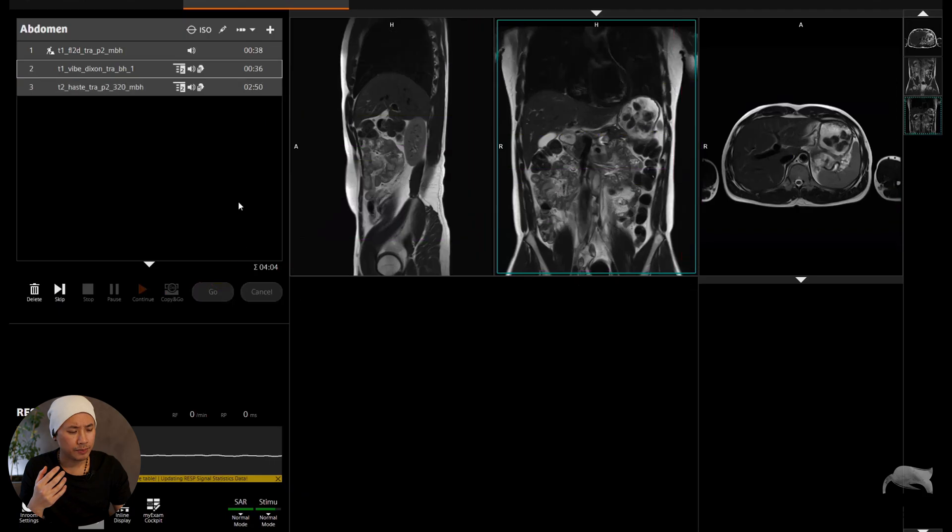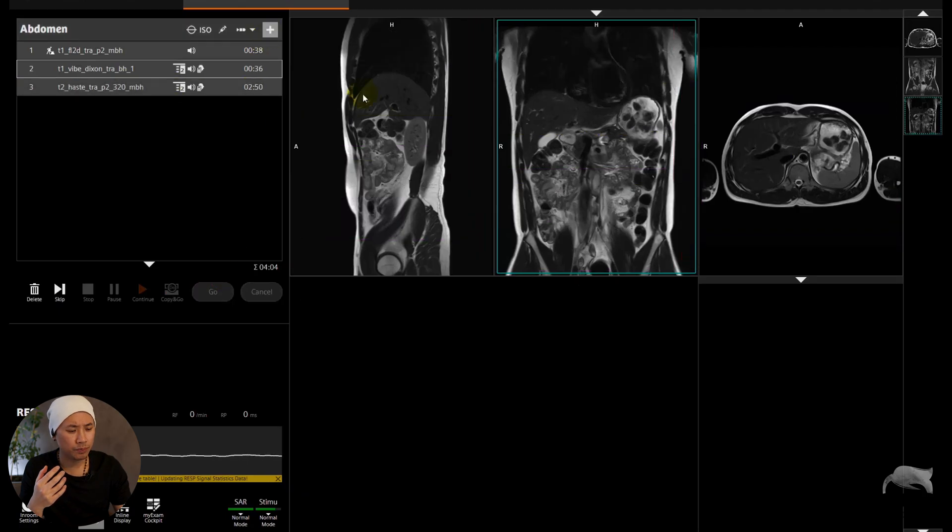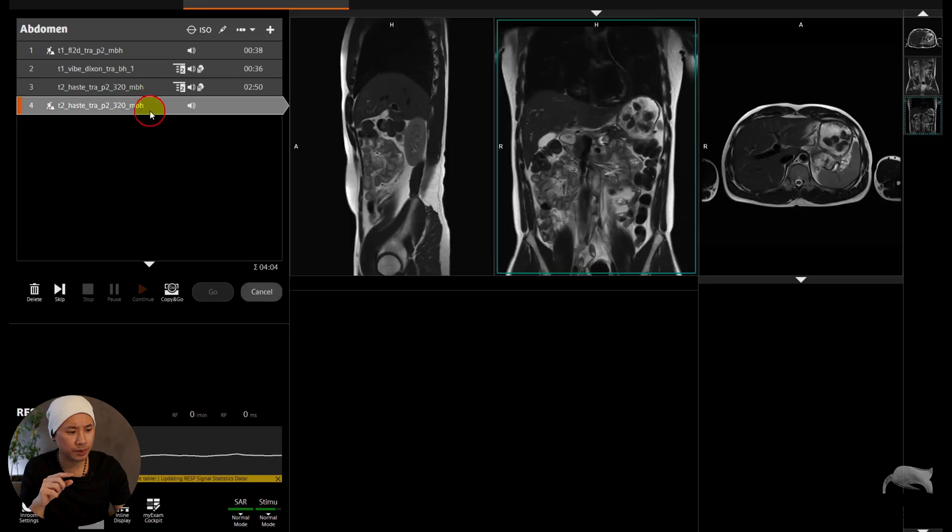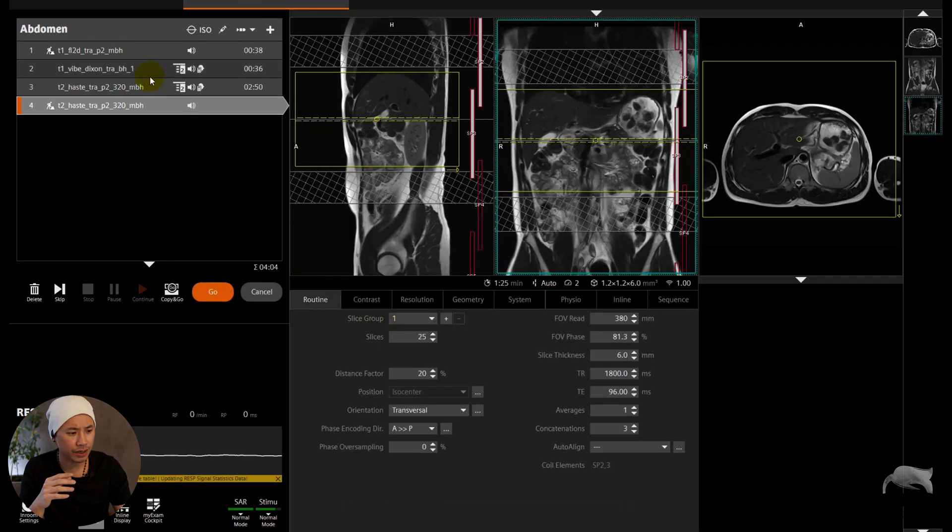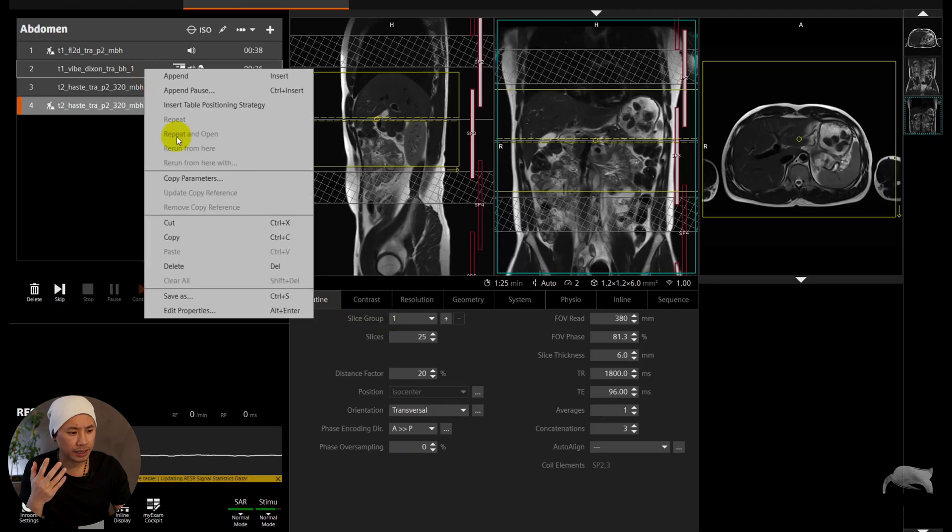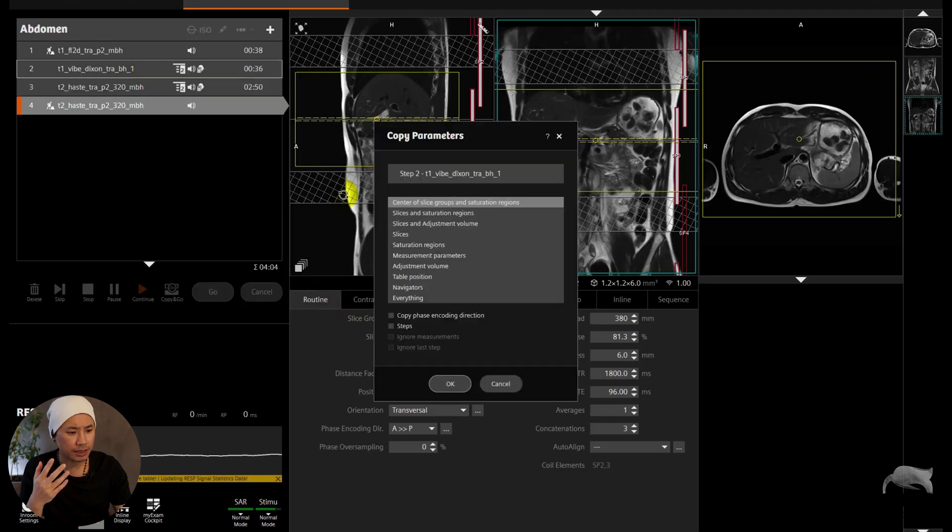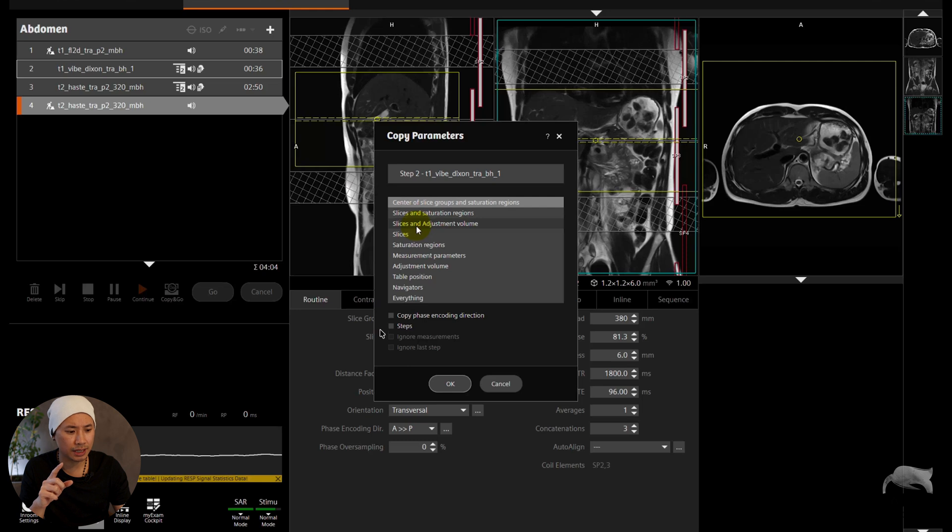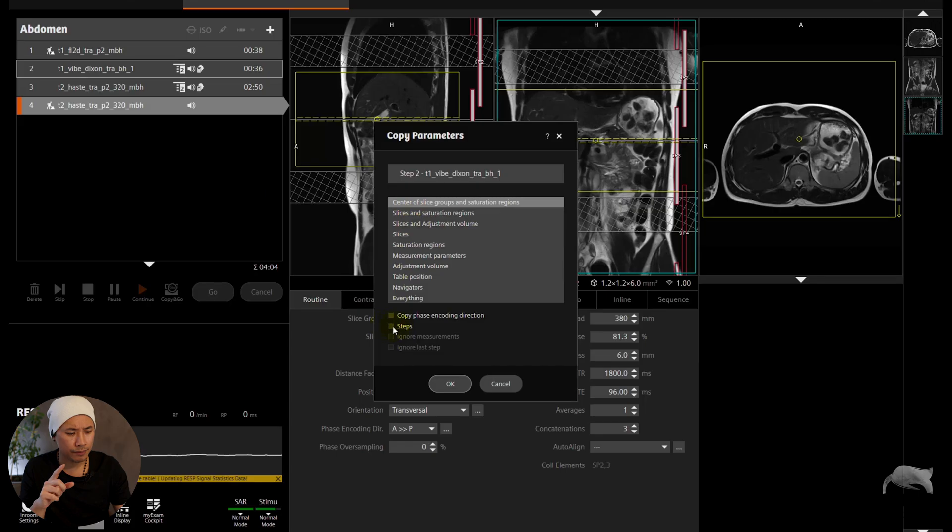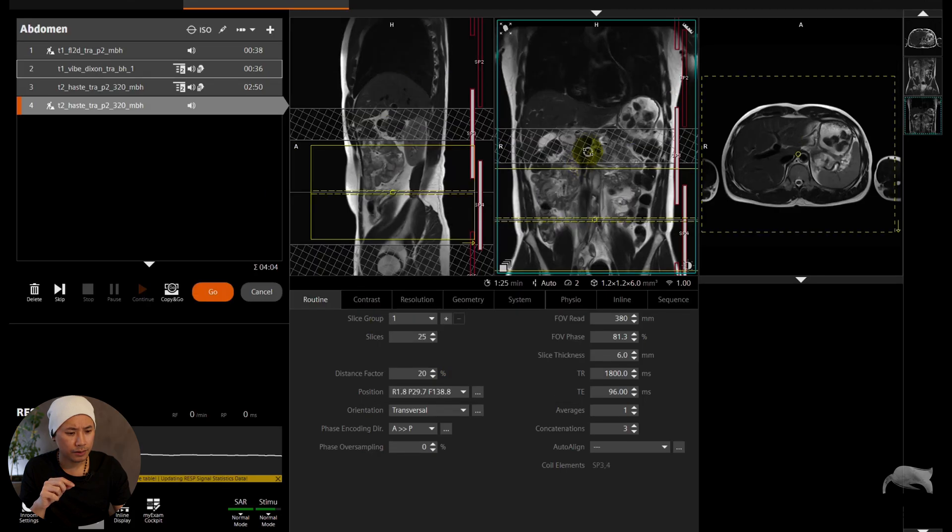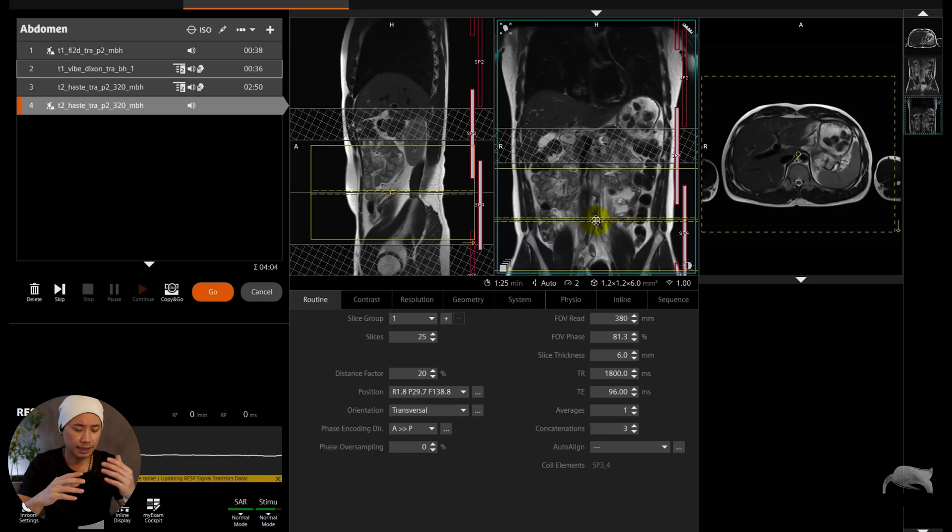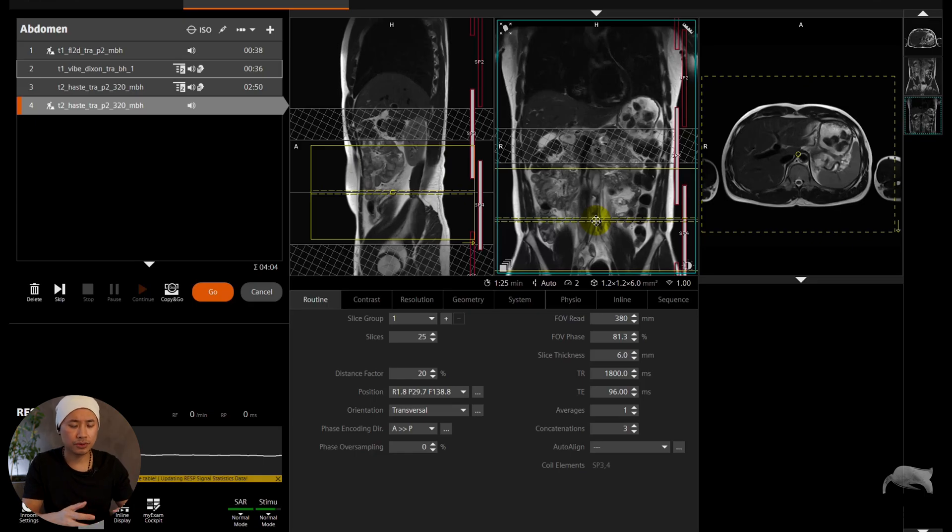And let me show you what happens if you don't push that magic Step button. So let's open this one and you right-click, and you only choose Center of Slices and you didn't take on the Steps. So let's see now.